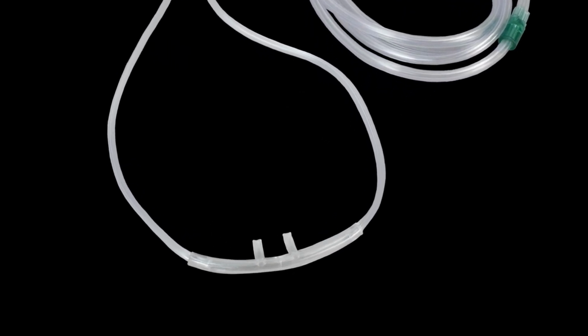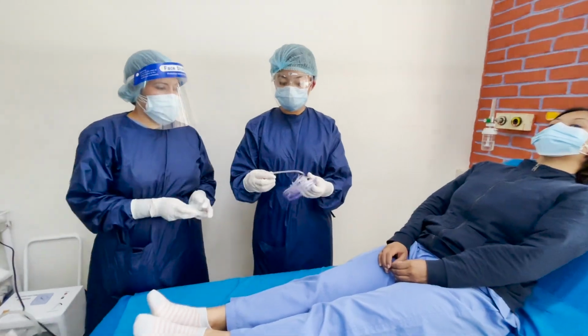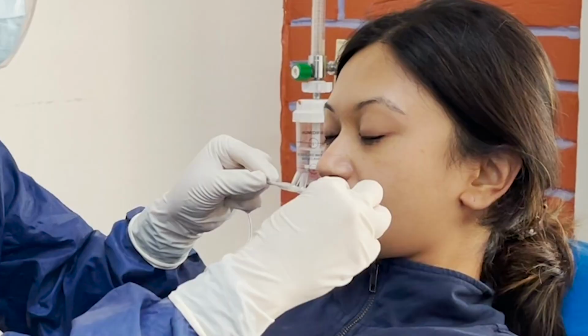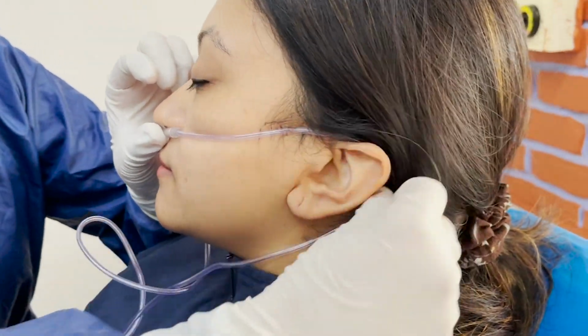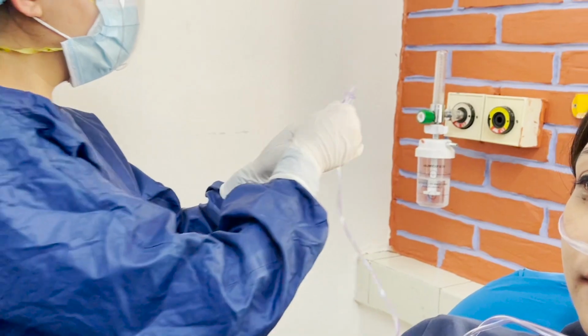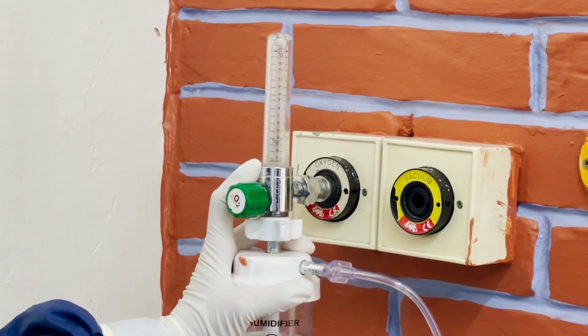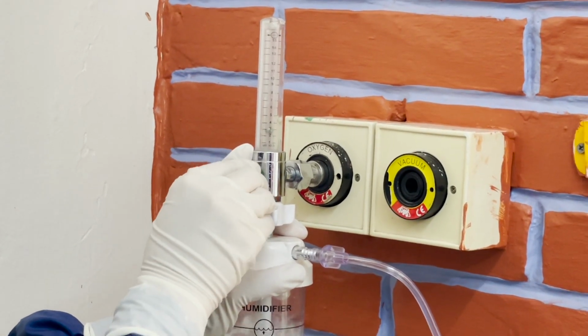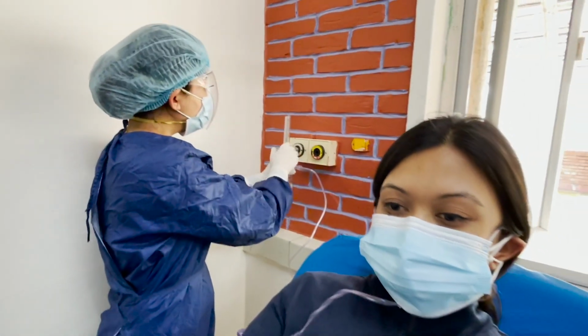If the patient has only mild respiratory distress or low oxygen saturation but is breathing rather comfortably, we can provide oxygen via nasal prongs. A nasal prong is a hollow tube with 2 prongs inserted into the nostrils and secured in place by hooking it behind the ears, and the other end connected to some oxygen source. We need to apply a surgical mask over the nasal cannula to minimize aerosol dispersion. The oxygen source should be turned off before application and removing the nasal prongs.